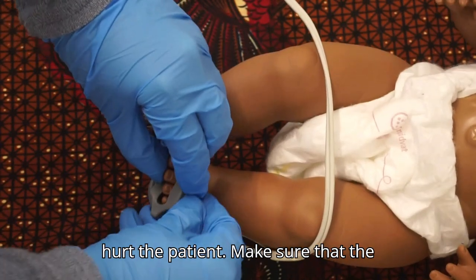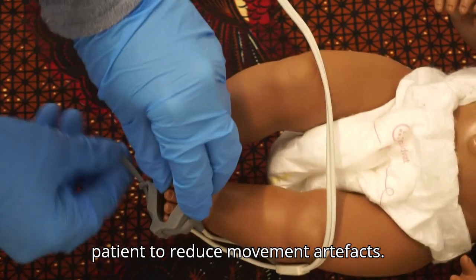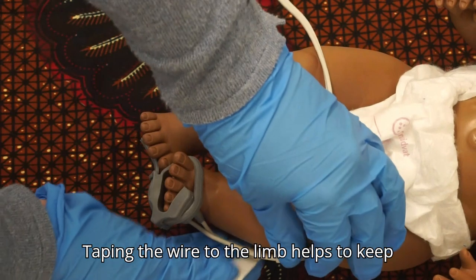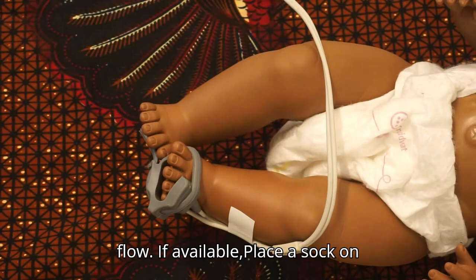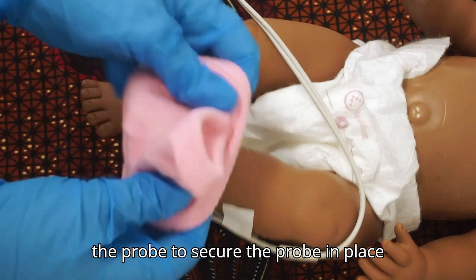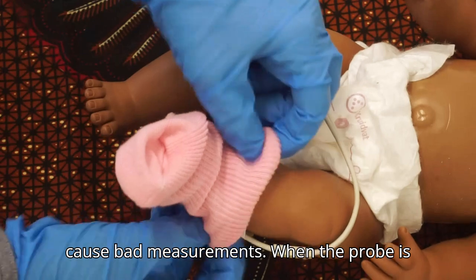Make sure that the wire is running along the limb of the patient to reduce movement artifacts. Taping the wire to the limb helps to keep it secure. Don't tape completely around the limb, as this could restrict blood flow. If available, place a sock on the probe to secure the probe in place and to reduce light. Too much light can cause bad measurements.